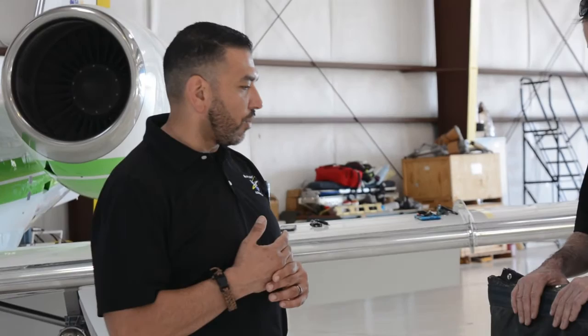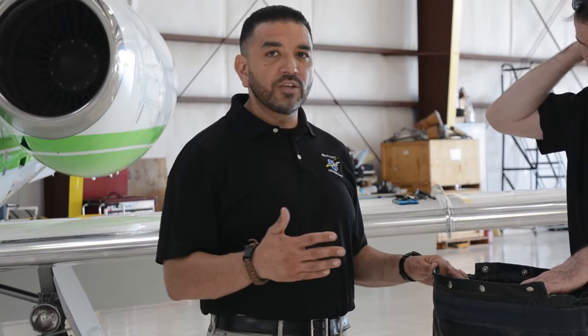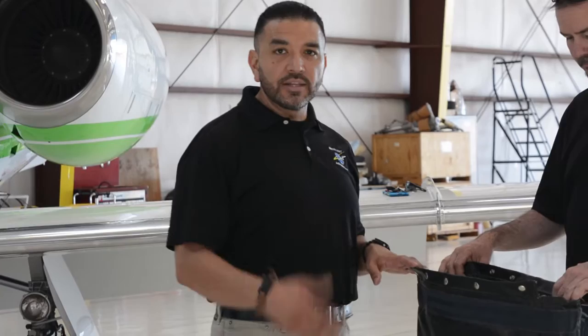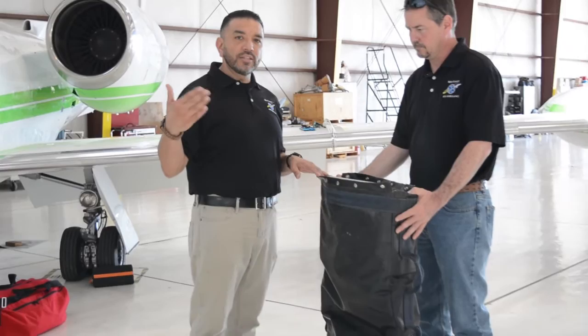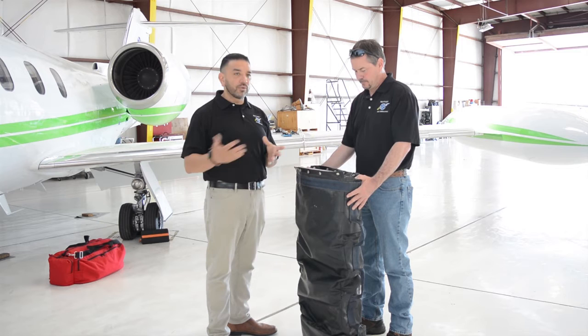So as far as getting the ramp ready, any patient that is going to be over 200 pounds, it is mandatory that we use the ramp. Of course, the ramp can be used on any patient if you feel like you want to use the ramp. It is actually safer, it can save your back, so there's less lifting involved. So one of the ways you can do that is if you're at the hospital and you find that the patient's going to be heavy, or you feel like you're going to use the ramp, you can always have dispatch call the pilots at the airport, and so they can have it ready at the aircraft for when you get here, so it'll be a little bit quicker as far as getting it ready.